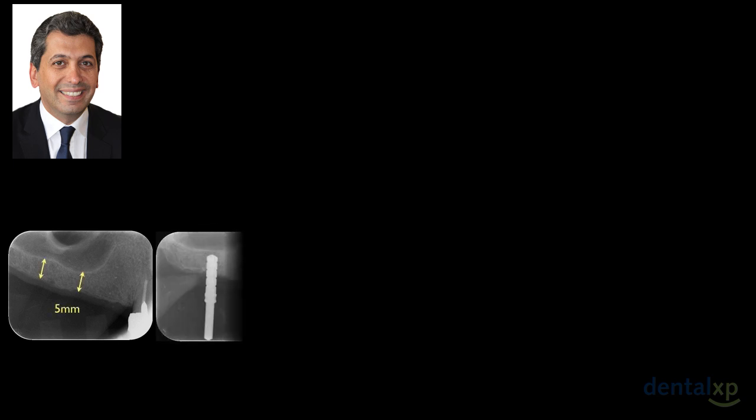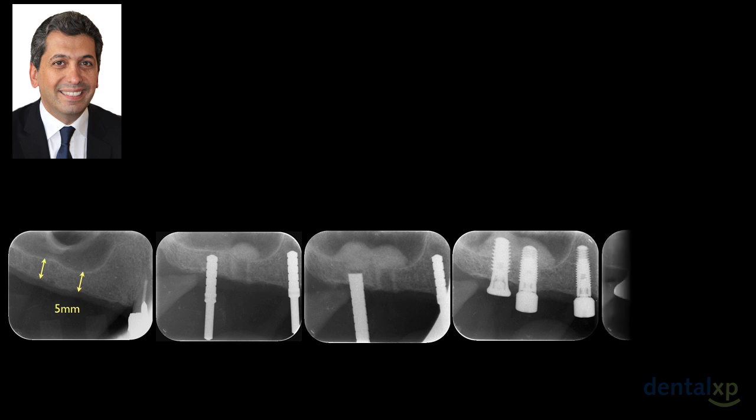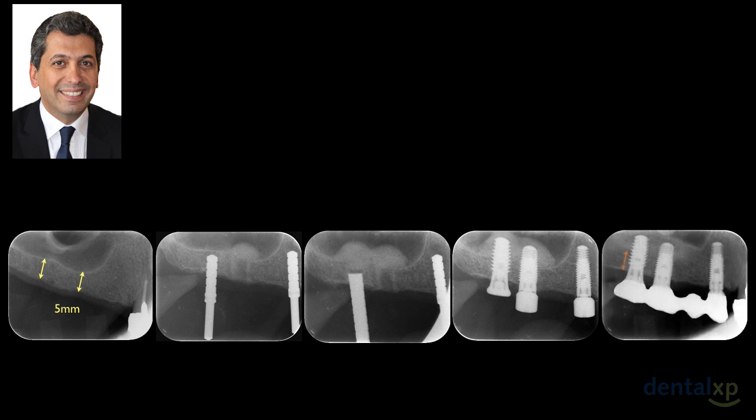Like this case, we have 5 millimeters. We perform the same technique I showed you. You can see how we have this beautiful dome of grafted bone inside the sinus. We placed our implant, and we could predictably elevate our sinus from 5 till 10 millimeters in this case.